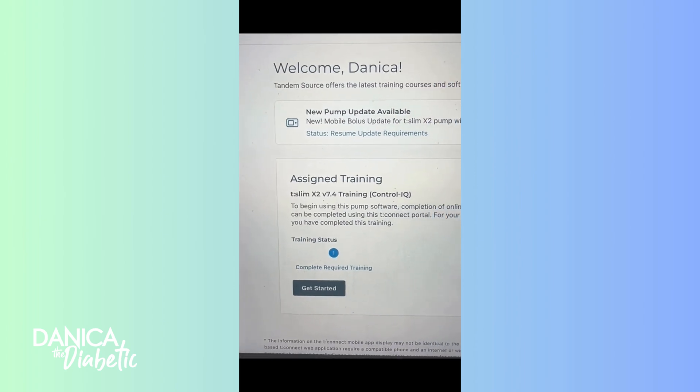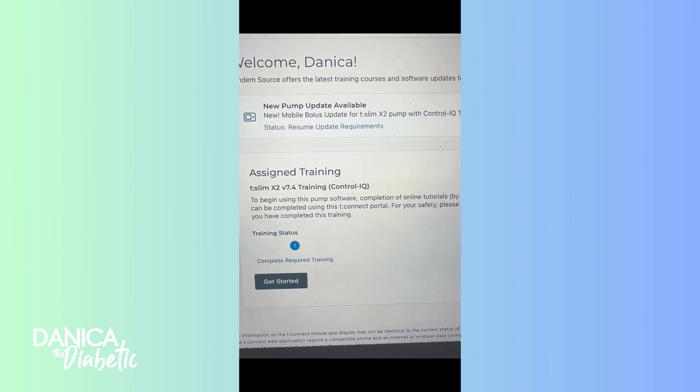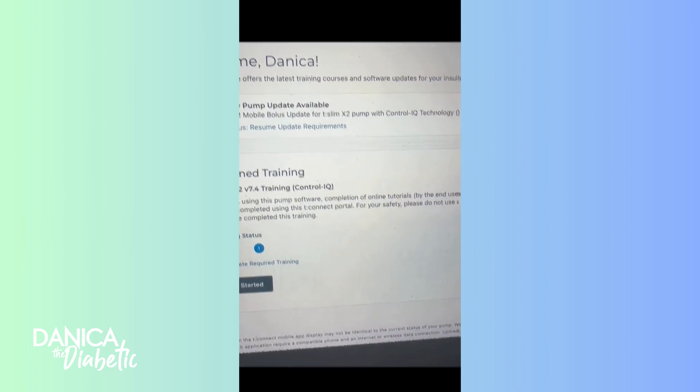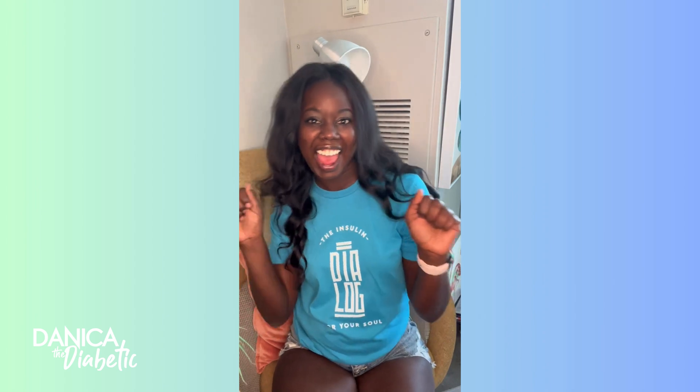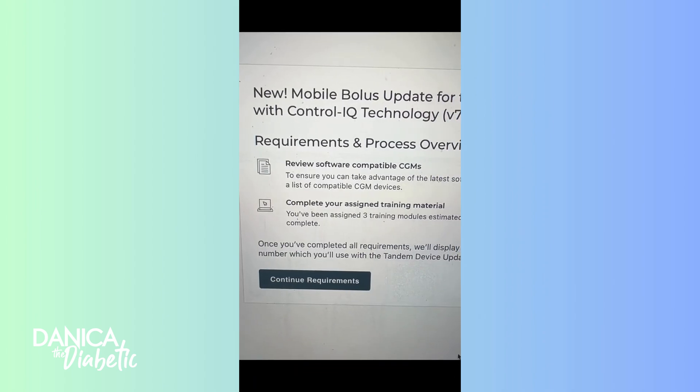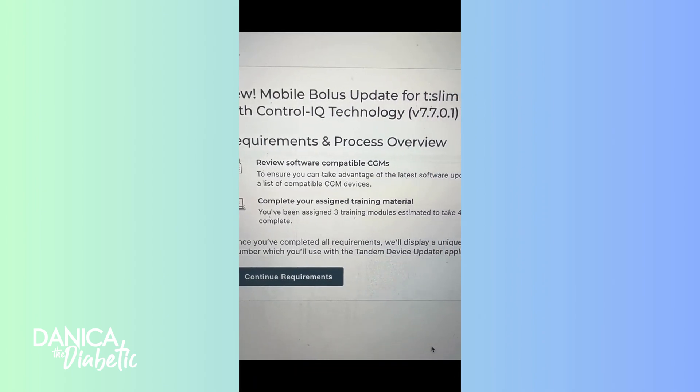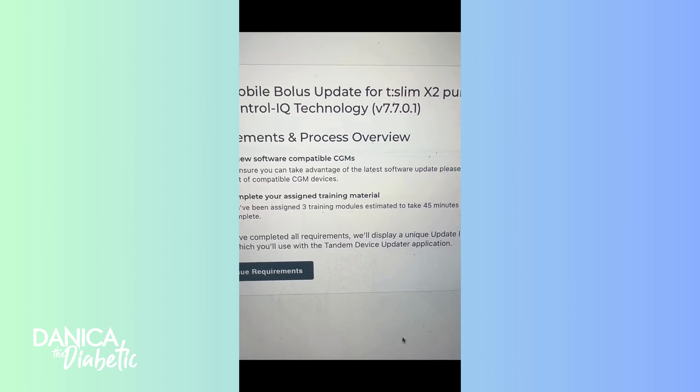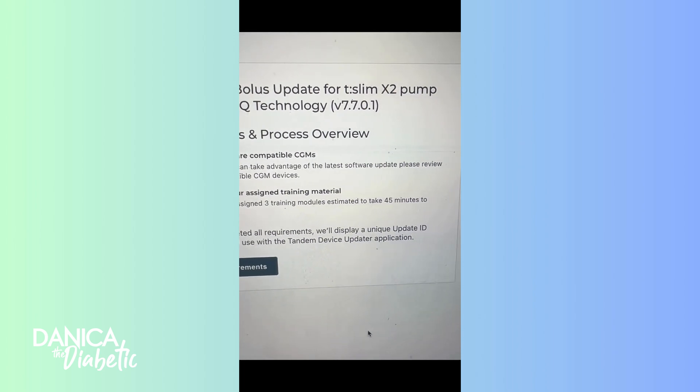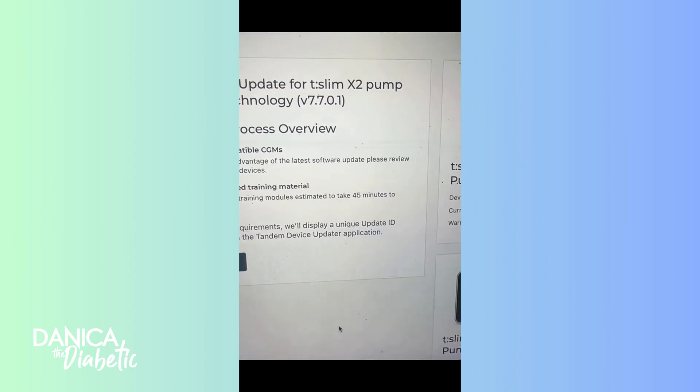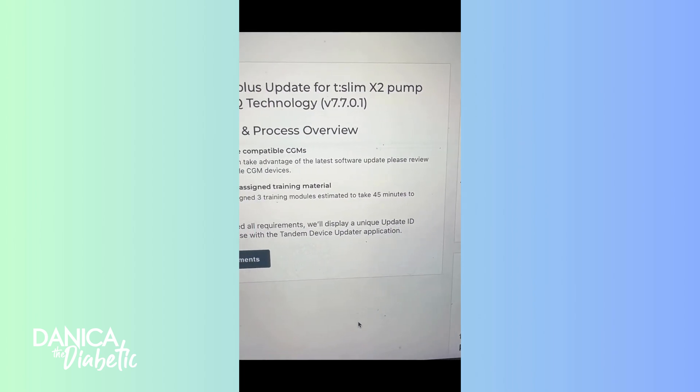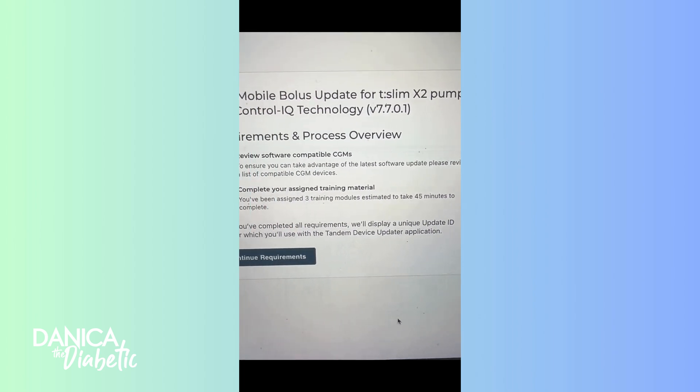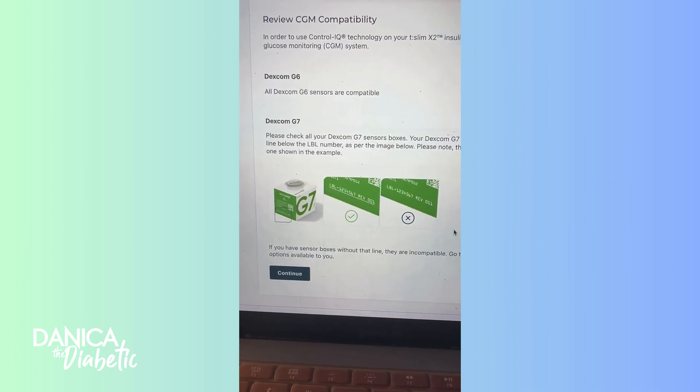Now I want to talk to you about how to actually get started with this new training. When you log into your Tandem account, you'll be prompted to say hey, you have some new software. Let's do this. So it gives you this lovely page and you start to click the buttons to understand your requirements and how to do it.